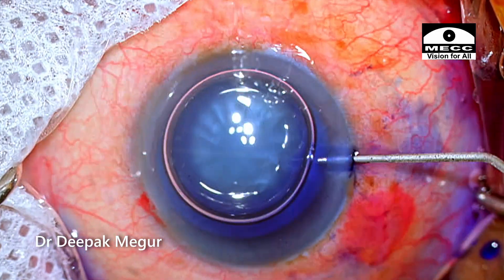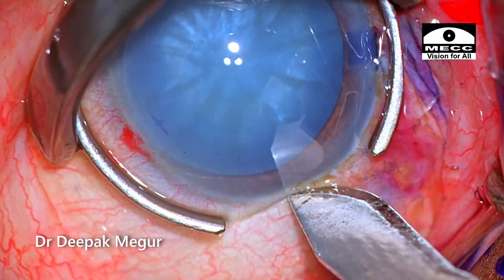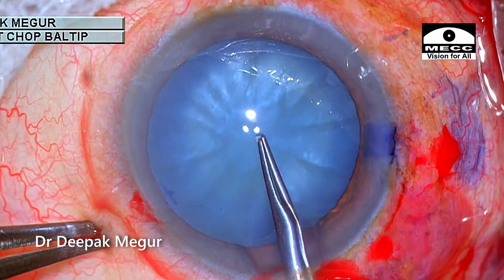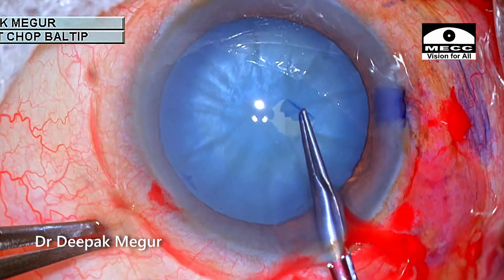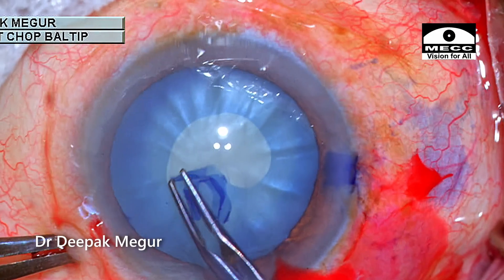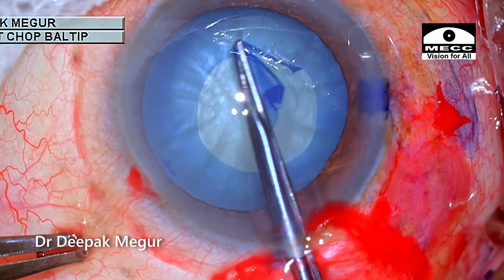The capsule is stained and OVD is introduced into the eye. It's time to perform the rhexis. My initial plan is to do the two-stage rhexis, but as I begin, I assess that the capsule is not that tense. So I changed my plan and am now doing the swirling or spiraling technique.